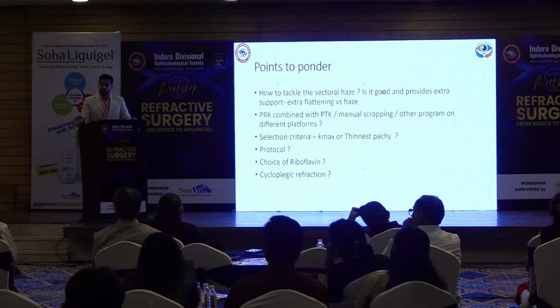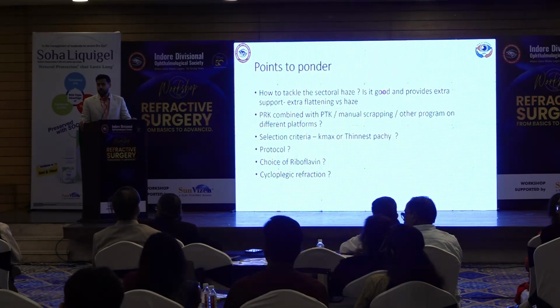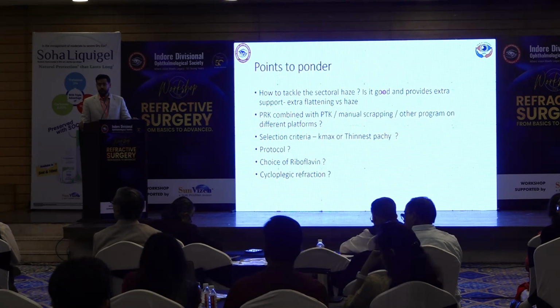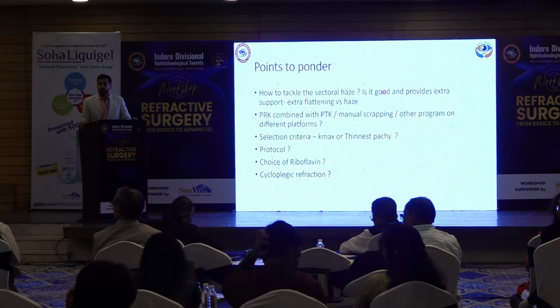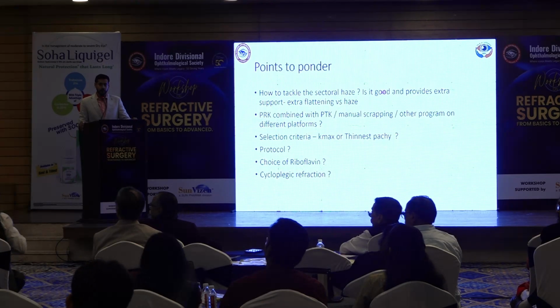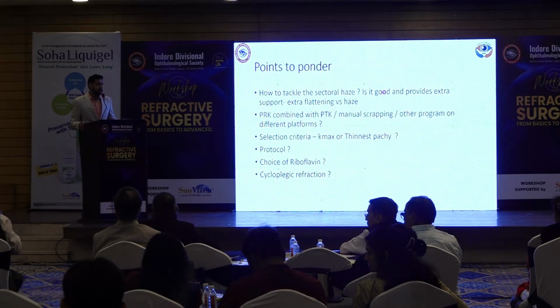Accelerated collagen cross-linking, at 9 milliwatts or 18 milliwatts, is the best thing to do, but titrate it to the pachymetry. Use the calculator; post lunch Natasha will tell you how to use it. We have designed it, we have published it. It is given free, anybody can use it. So thank you, Saurabh.